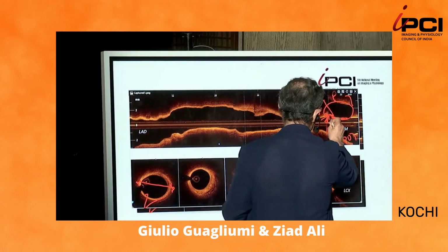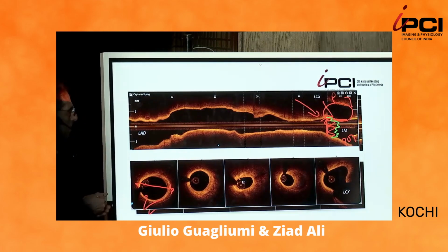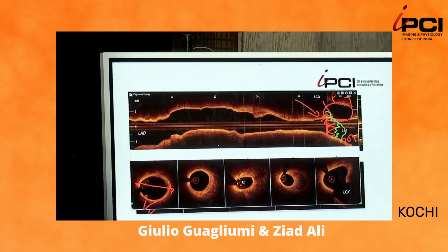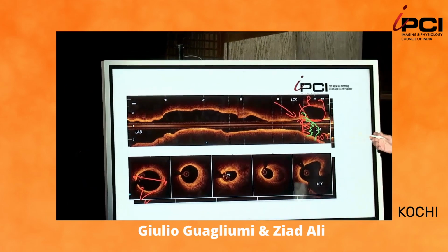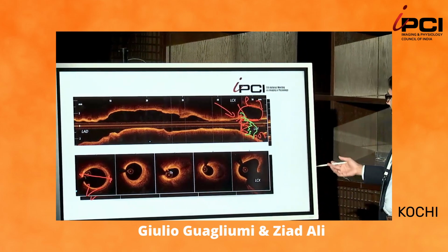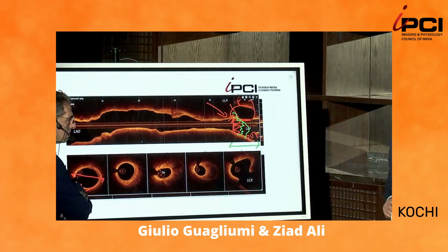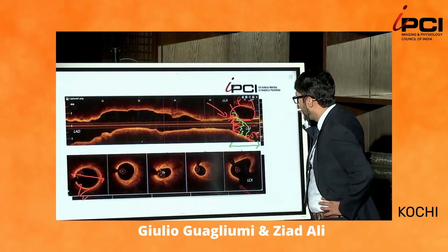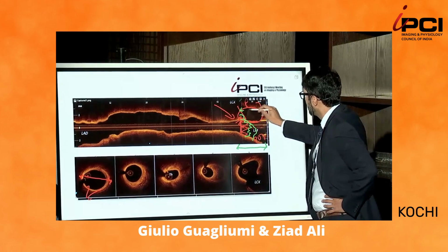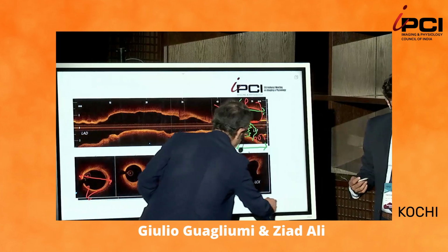Suppose that your stent is more protruding. What are you doing? In general, more protruding again? Very possible. It's very possible. And this is a potential problem with stenting across the ostium. However, like I said, what really needs to be done here is to make sure that you have enough room to perform a proximal optimization. Because right now, according to my visual inspection by OCT, we have probably about 5 millimeters or so before we get to the aorta. And so I may or may not want to stent right to the ostium.